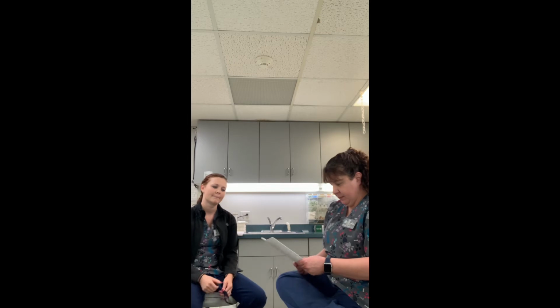How do we obtain readings? We send it off biannually to get it read. And when should it be worn? Anytime you're taking x-rays. Where should it be worn when taking x-rays? Usually up around the collar facing out, so the badge gets the most amount of scatter radiation. What is the MPD for veterinary staff annually? Annually, it is 5,000 millirems.